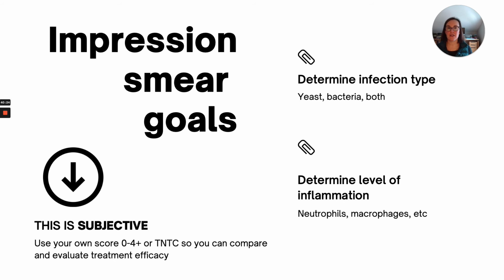Like you're either seeing no bacteria and this patient has resolved its bacterial infection, or you're still seeing bacteria or yeast. And splitting the hairs between whether it was a 3+ when my colleague saw the dog and now it's a 2+ is not really that important. If we're really getting into that level of specificity, then maybe as a clinic, you guys can decide, okay, do we have some sort of yardstick that we're going to use that anything over a 2+ is going to get systemic treatment, anything under is going to get topical. But even with my own practice, I don't do that. There are some cases where baths seem like a great option, and other cases where it's probably a better idea to treat systemically.